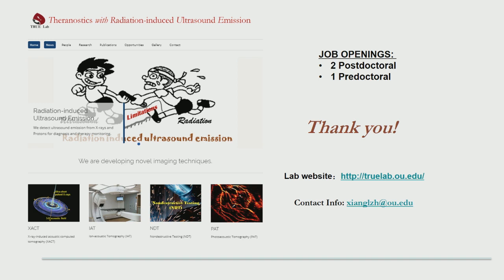So you get three pieces of information. Number one, you have the attenuated X-ray hitting the transducer, and that's the same information as the previous X-ray absorption-based imaging. And then you generate an ultrasound wave inside the bone, so you have 3D information with a single projection. And then another piece of information is that you generate an ultrasound wave on the transducer.